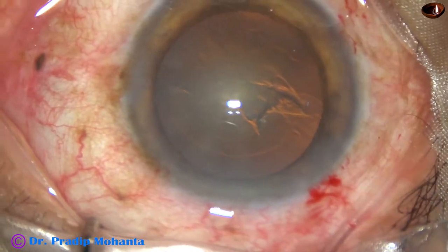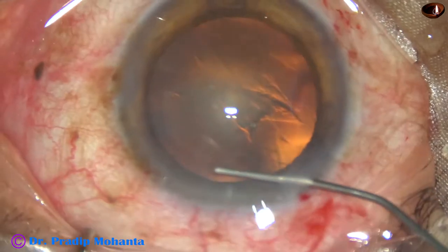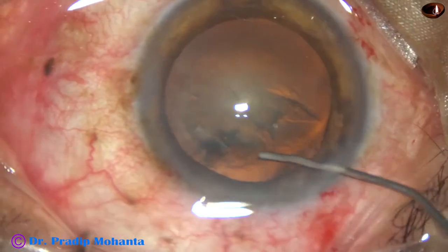Now hydrodissection is done. BSS is passed just under the anterior capsular rim. The fluid wave goes to the opposite equator.